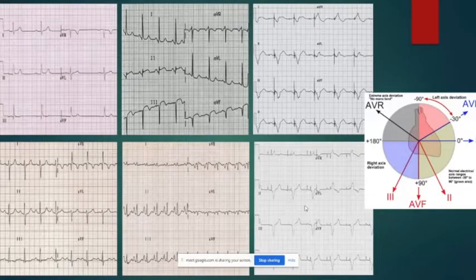So, heart rate. How can you define the heart rate? You can work out the time difference between the peaks and do it that way. Yes, but how can you do that? I think we have a standard velocity in the detection of the machine. Yes, we usually use 25 millimeters per second, and you are defining the R intervals. You are using that to measure the rate, right?